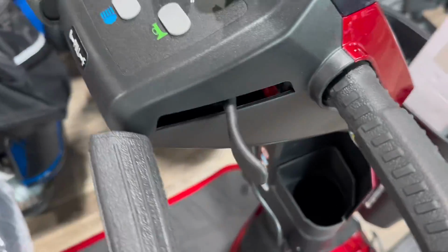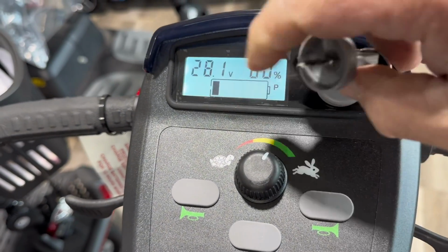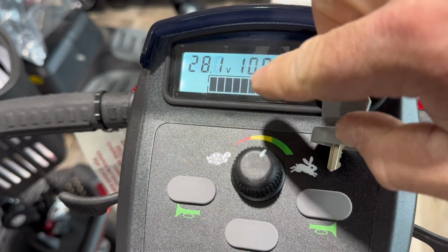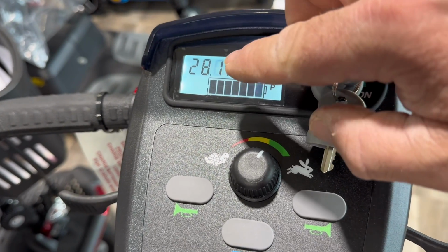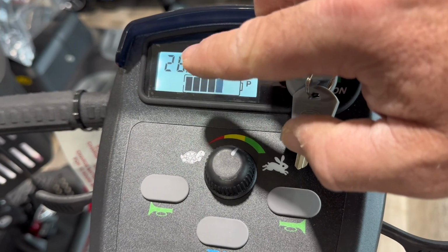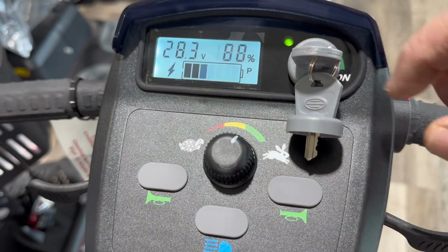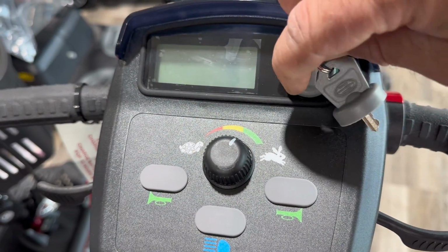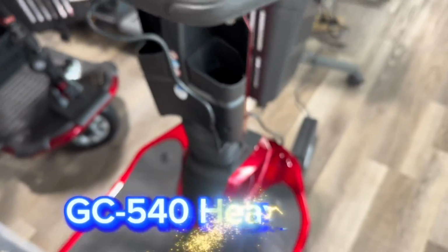You also have your digital dash. It's just showing it's going through a charge, where it's charged at. So this dash will show you if your charger's working too, because if you have it unplugged, it'll be at like a 20, whatever it would be. If it came up from 25 to 28, you know the charger's working. So turn that off. Yeah, it's nice.